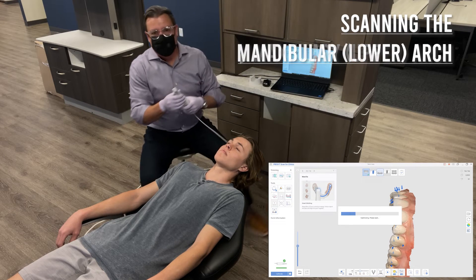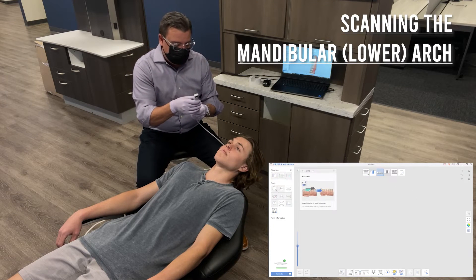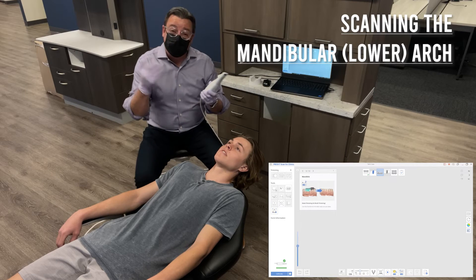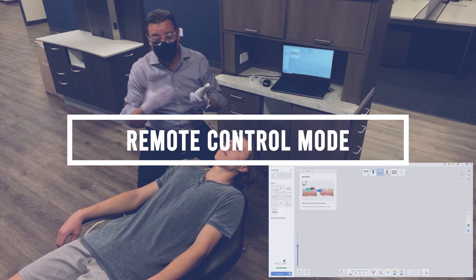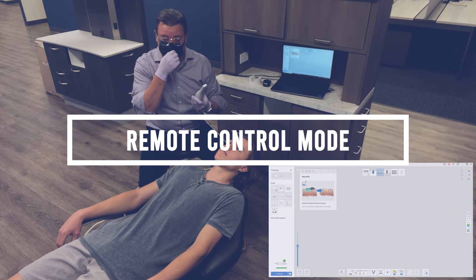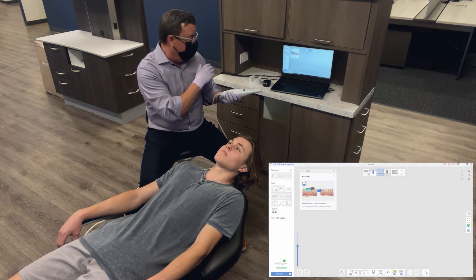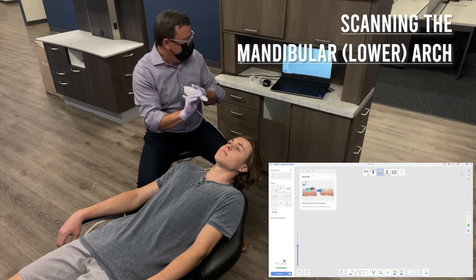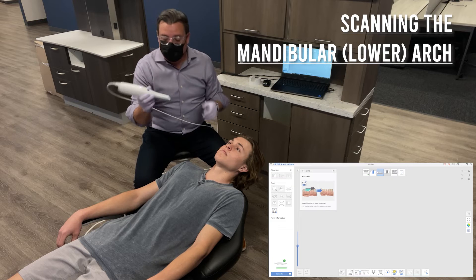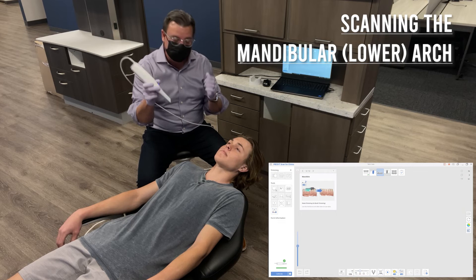We will move on to the lower. I'll also say there is a joystick feature with the Medit i700 — I personally haven't gotten used to it yet so I'm using the mouse. However, there is a feature where you're able to scan without having to go back and touch the mouse or keyboard. Just wanted to throw that out there. I'll also move the tip so that I'm set up to scan the lower arch.